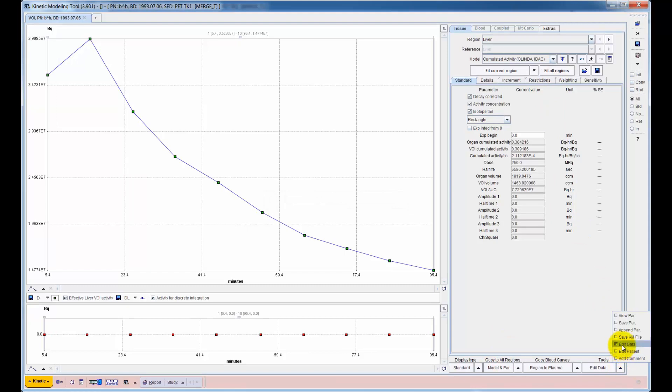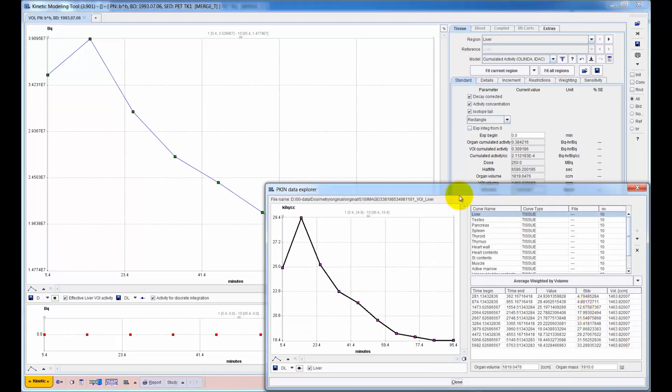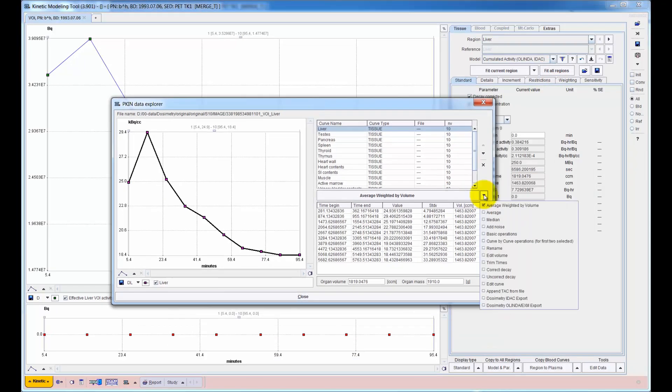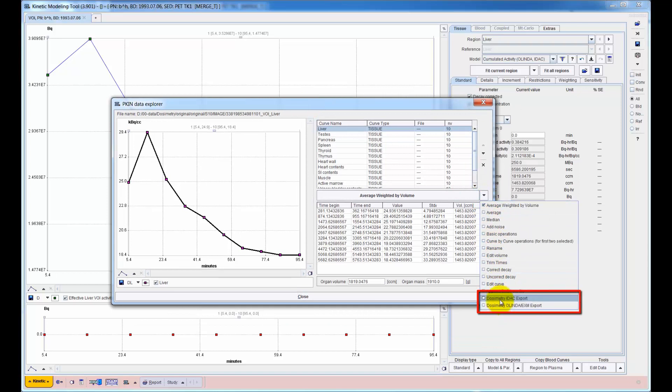Finally, the normalized accumulated activities are exported into a file which can be loaded in Olinda EXM or IDAC2.